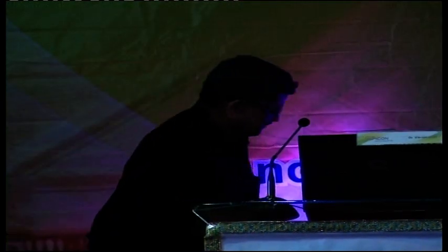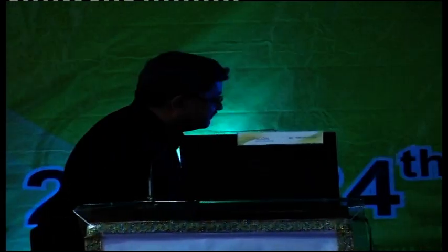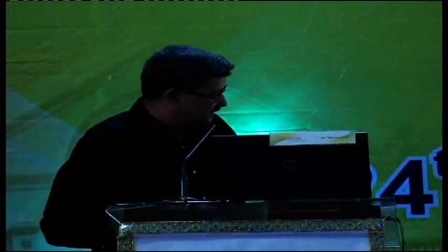Dr. Lele, what preparation should we do before sending for a PET scan? Well, usually we want the patient to be fasting for at least 6 hours. And if he has diabetes, it has to be controlled because the natural sugar competes with the radioactive sugar. So if there's too much high sugar, my radioactive glucose will not go into the lesion. So it has to be completely fasting. That's about it. 6 hours fasting.